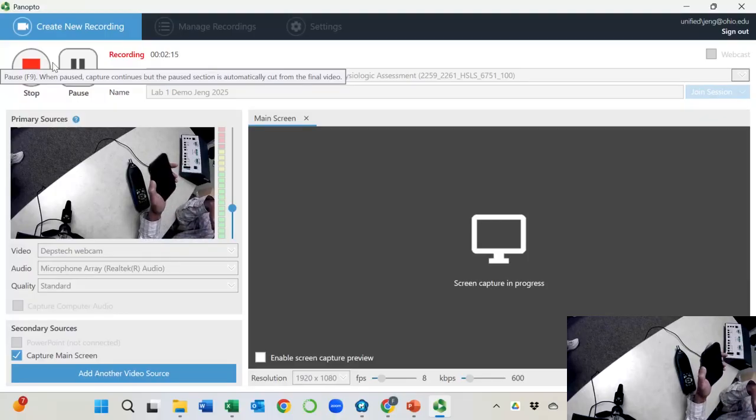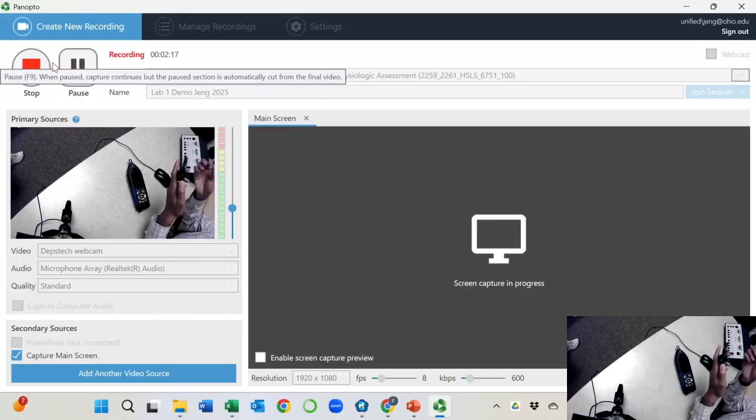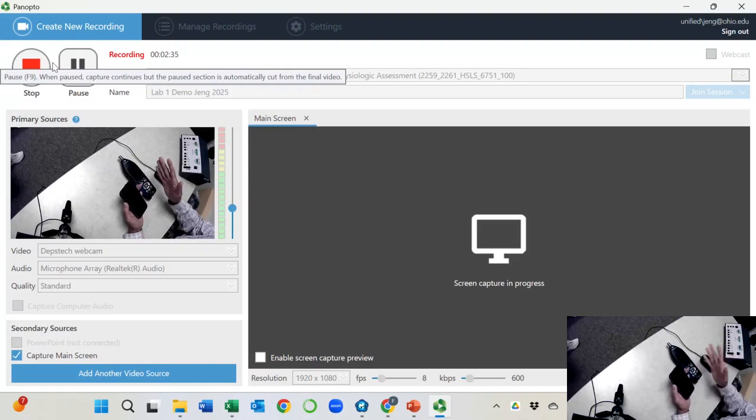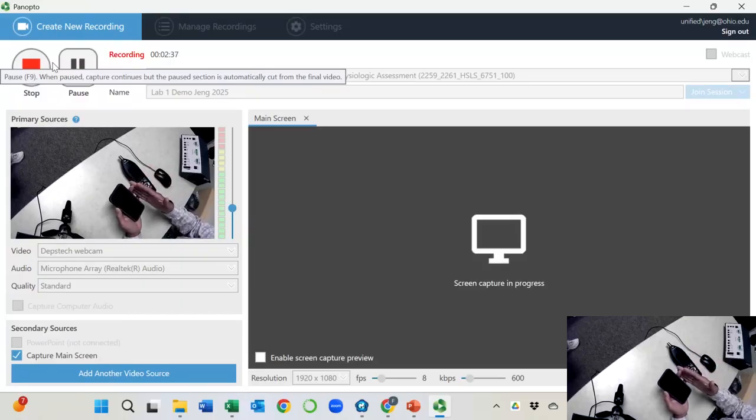Basically, that's it. All the rest, software and apps will deal with that for you. So just so you know, nowadays people are switching to using cell phones to calibrate. So this is becoming out of date. If you attend the ASHA conference or similar, there are booths for sound level meter companies. They do sell software and hardware, but their focus is shifting toward app software, because you can even download some free apps, and some of those are really good. I'm not kidding you.